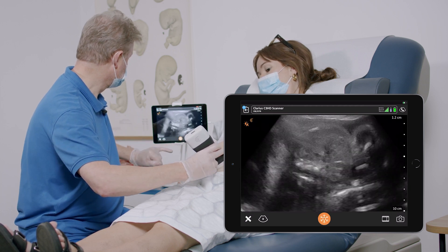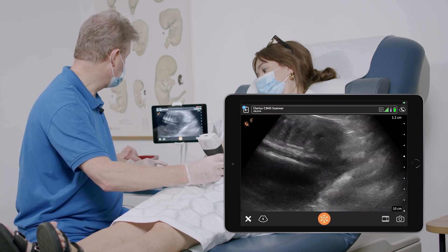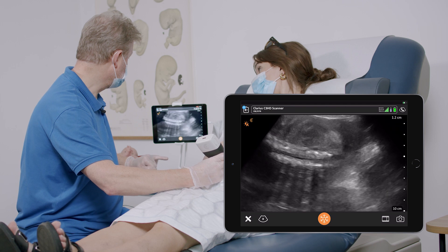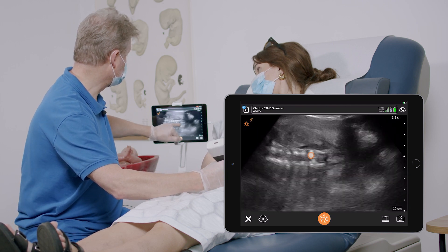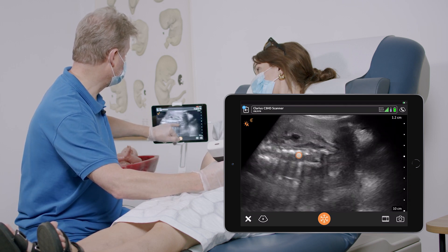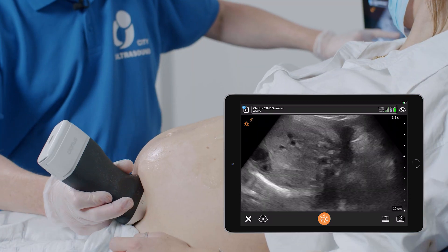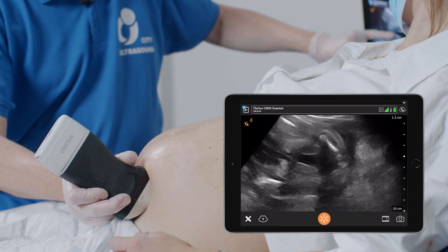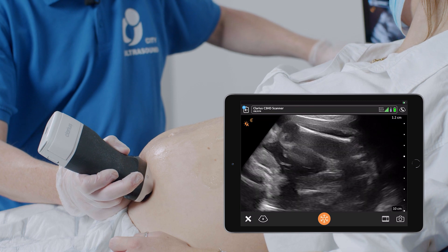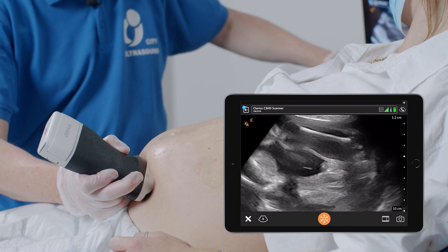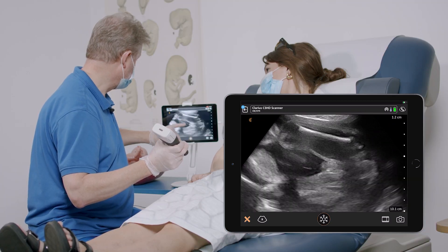I'm going down to see the femur, moving down to the posterior part of the sacrum and just rotating the transducer, getting this image of the femur. This is the measurement of the femur.